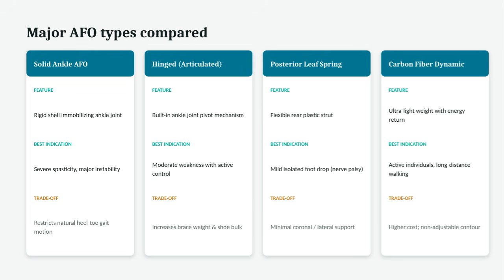Finally, the carbon fiber dynamic AFO is ultra lightweight and provides energy return with each step. It's perfect for active individuals who need to walk long distances. The trade-off here is the higher cost and the fact that its contour is non-adjustable.